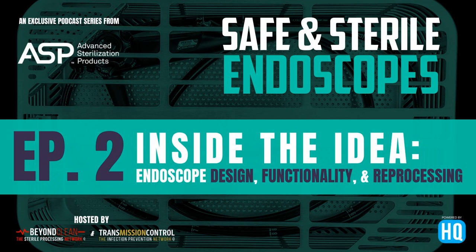And we're certainly not going to tell anybody that you can't high level disinfect. That's going to be facility by facility for their preference. But again, you've got to think about what that is doing to the scope when we're high level disinfecting and we're going to sterilize each of these scopes. But we also know that they're already sending them down for ethylene oxide, which is very, very harsh on the scopes. So they're already used to ERCP scopes either going out for repair a lot sooner or going out for that surveillance to make sure that everything's still intact. So they're going to already be used to that from an ETO perspective. Now just shifting over to low temp, I think they'll see that extended out a few more cycles than what the ETO recommendation was.